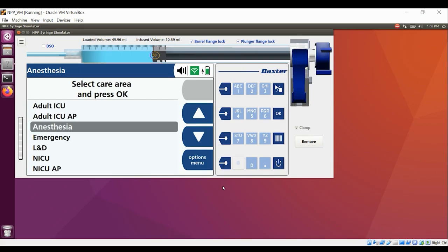Quick thing about rapid bolus. It's a wonderful feature. It boluses at the highest rate for the pump on the LVP, but on the syringe pump, it boluses at the highest rate for that loaded syringe. I have a 50 ml syringe loaded here, so I can go at 1200 mLs per hour. But a smaller syringe is not going to be able to deliver at that fast rate. It will be a lower rate. And to that note, when you're demoing, use a 50 ml syringe, because that's typically what they're going to be using as well, a 50 or 60 ml syringe.